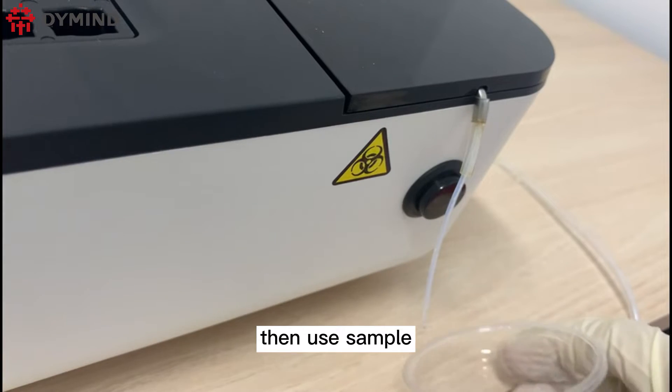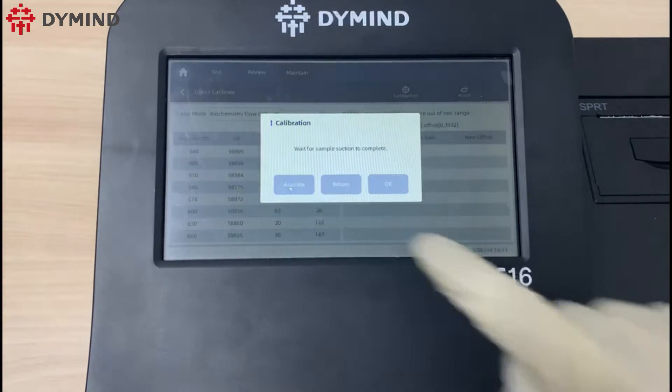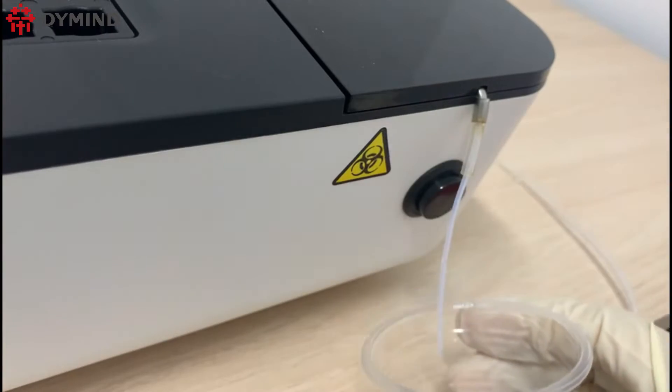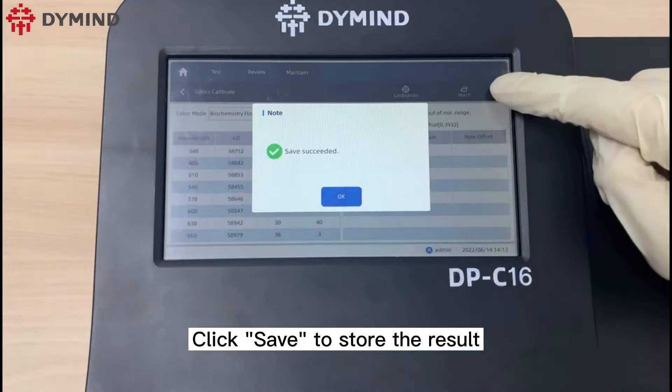Then use the sample tube to aspirate the pure water for calibration. Click save to store the result.